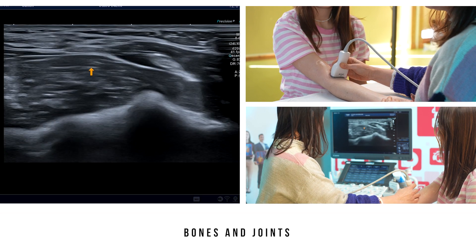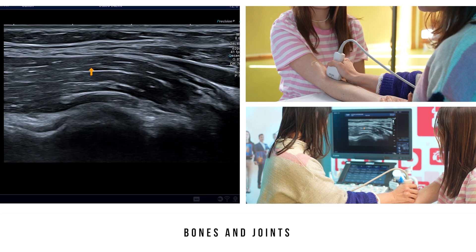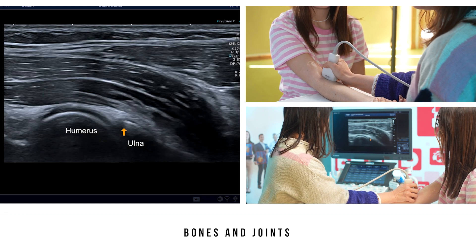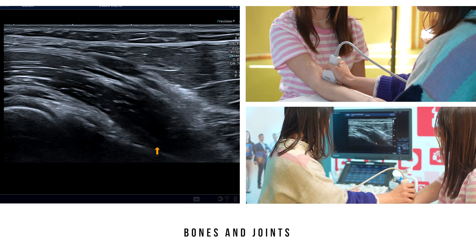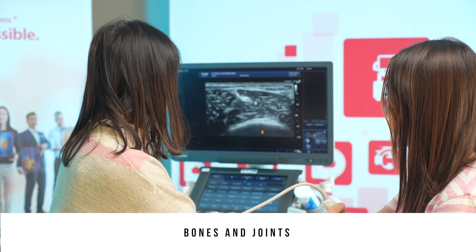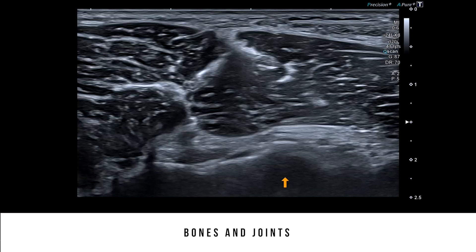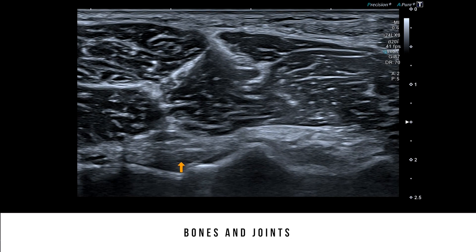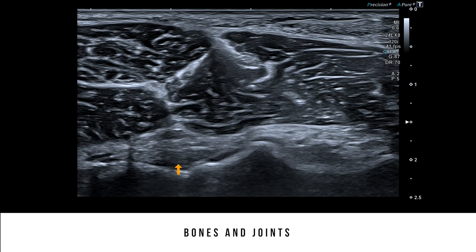Next, we shift the probe medially. In the sagittal plane, we can see the joint between the humerus and ulna, located right below the brachialis muscle, which we can follow to its distal enthesis on the lower portion of the coronoid process of the ulna. To complete this analysis, slide the probe upwards to locate, immediately above the trochlea, two fatty pads on the ulnar and radial aspects. Below these you will find the anterior articular recesses. By analysing these specifically, you may be able to see a small amount of effusion in some cases.